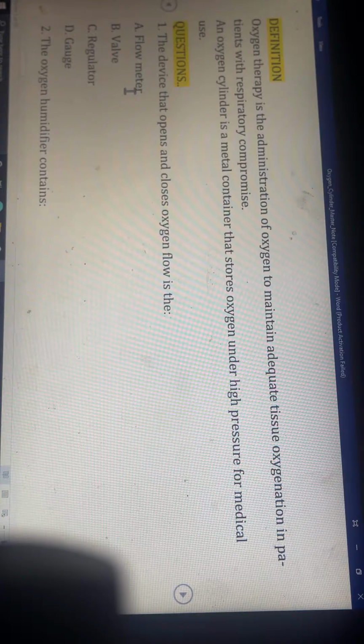Question: I want you to answer these questions in the comment section because you must pass your exams. Number one, the device that opens and closes oxygen flow is A, the flow meter, B, the valve, C, the regulator, D, the gauge. What is the answer? Please send your answers in the live comment.